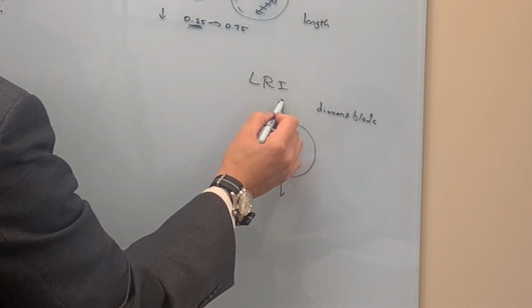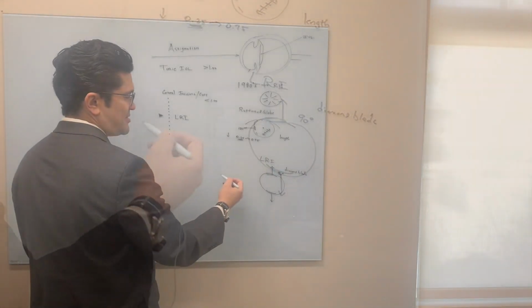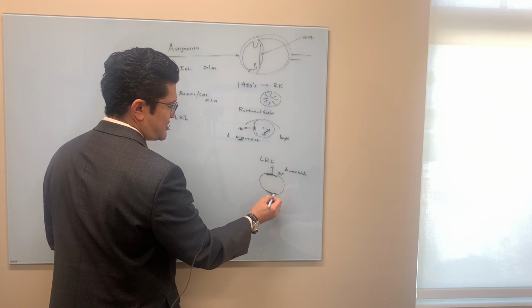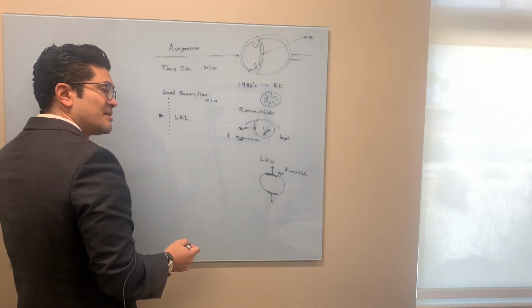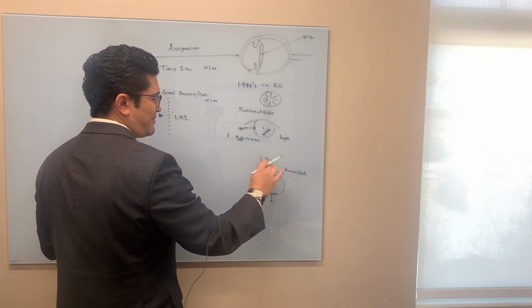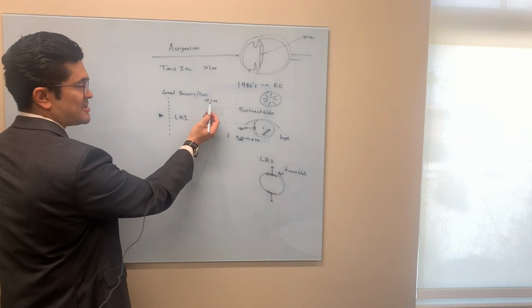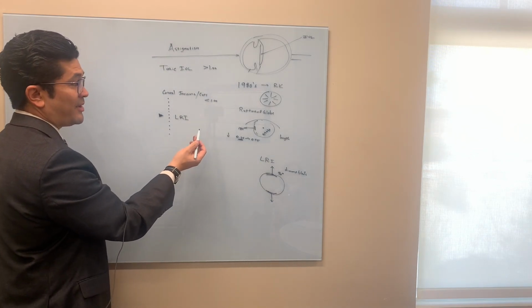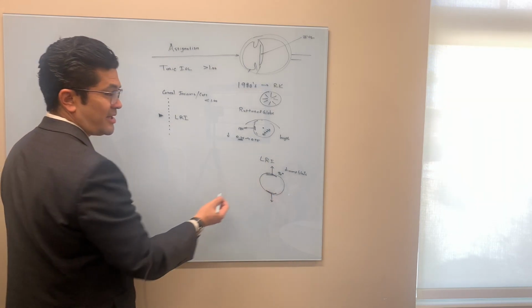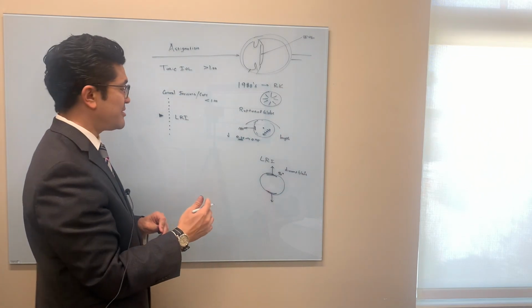So let's say your steep axis was 90 degrees. We're going to use the diamond blade to make an incision along the edge based on these formulas. And the diamond, by cutting the cornea, by making extra cuts in the cornea, is going to relax it to reduce the astigmatism. So if you have like 0.7 cylinder, you cut the cornea on the steep plane and that'll reduce the astigmatism, bring it closer to 0.